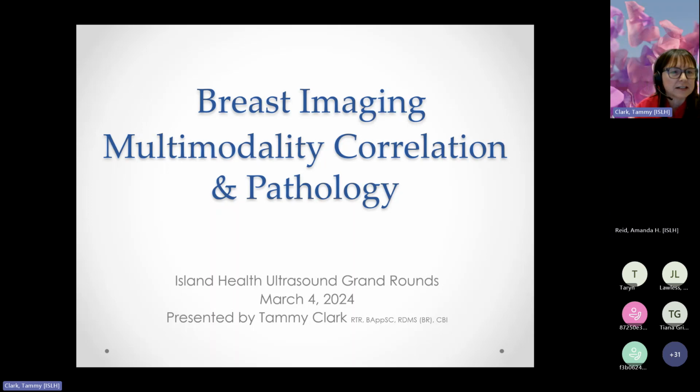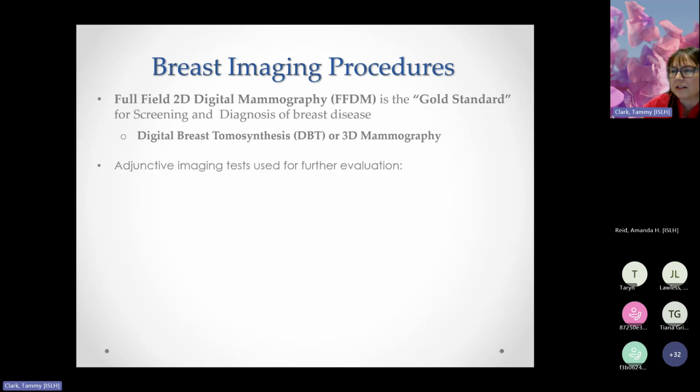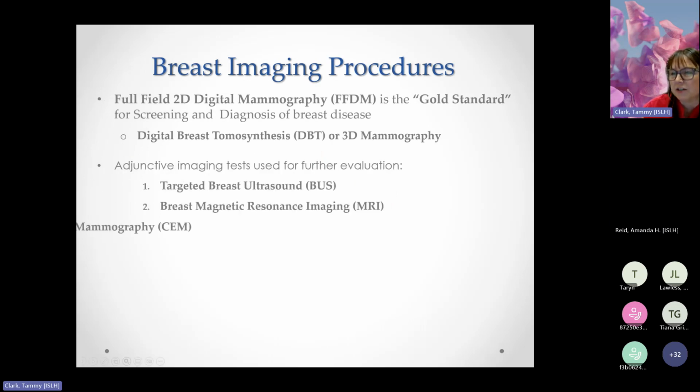So we'll get started. Today we're going to be talking about breast imaging and how it is such a multimodality approach and how we correlate not just with mammogram and ultrasound, but also with MRI and how we use the different modalities in breast imaging. So we have lots of different breast imaging procedures.